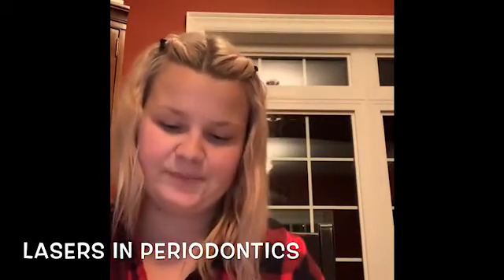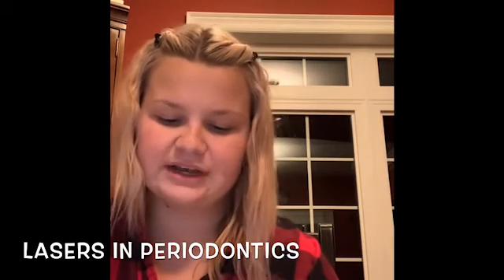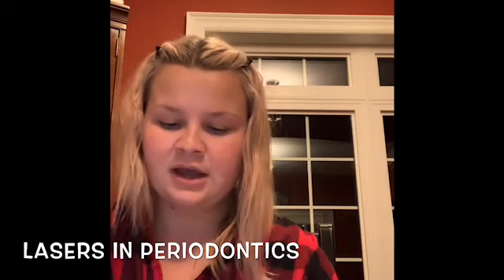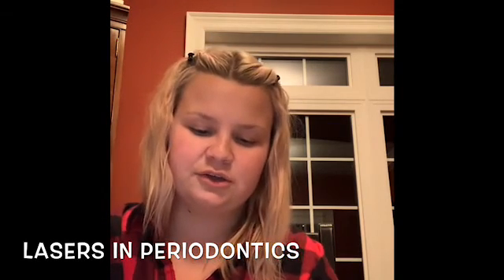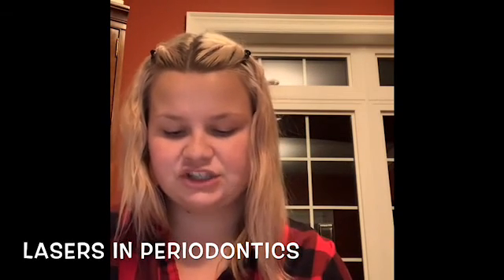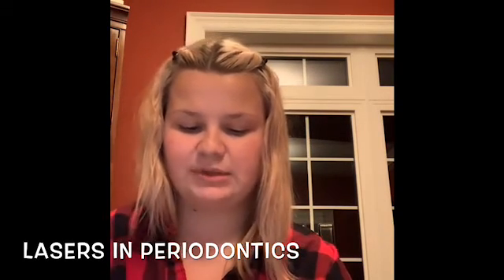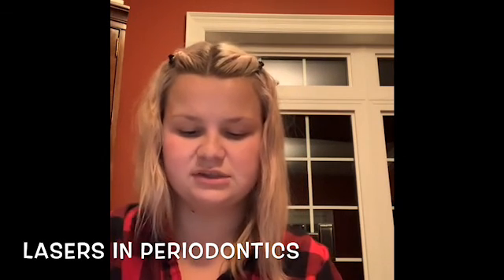A laser beam is a highly concentrated beam of light. The power of this beam can be adjusted to enable it to cut, vaporize, or cauterize tissue. Periodontal applications of lasers on soft tissue include the removal of tumors and lesions, vaporization of excess tissue as in gingivoplasty, removal of or reduction in hyperplastic tissues, and control of bleeding in vascular regions.